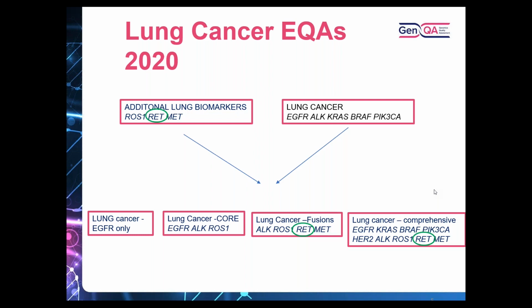So RET testing in 2020 was included in our additional lung biomarkers and in our lung cancer comprehensive, so our fusions and our comprehensive EQAs.